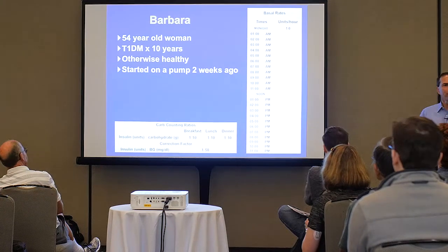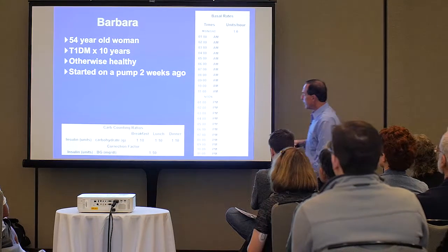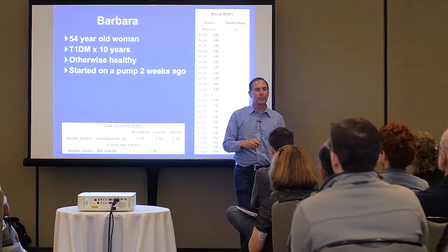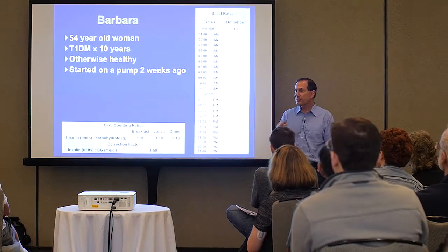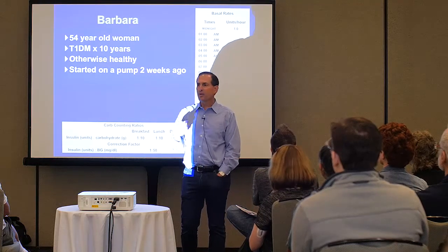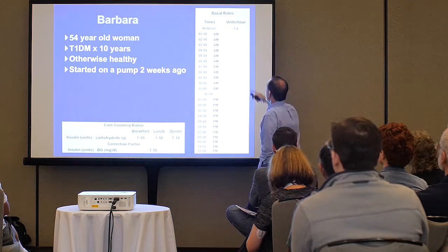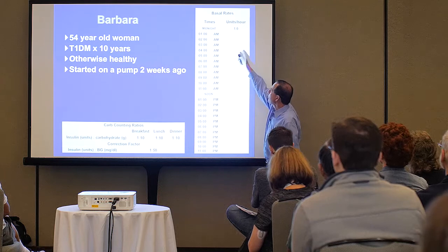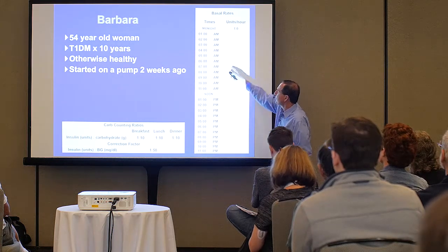Okay, this is your first patient. This is your patient, Barbara. She's 54, type 1 for 10 years, otherwise well, and you just started her on a pump 2 weeks ago. And just like you, when you started on a pump, I bet most of you were started on one basal setting. That's the usual way it's done. Probably one unit an hour, more or less. And that means that every hour your pump gave you one unit over that hour. I wrote it at the top, but it's the same hour after hour.